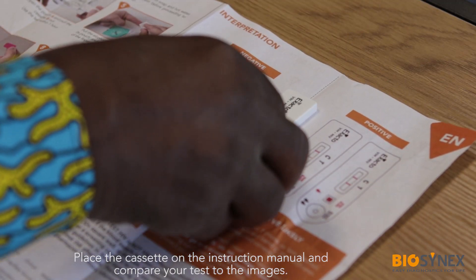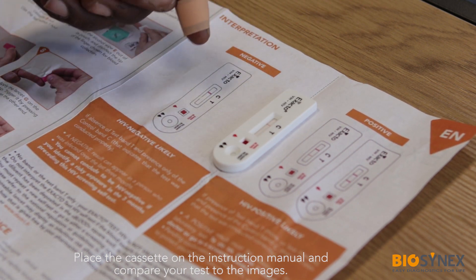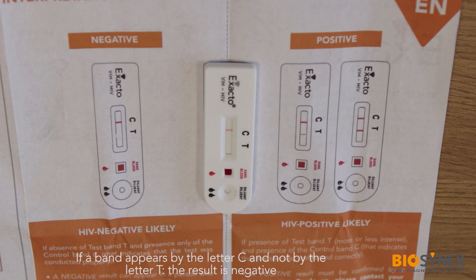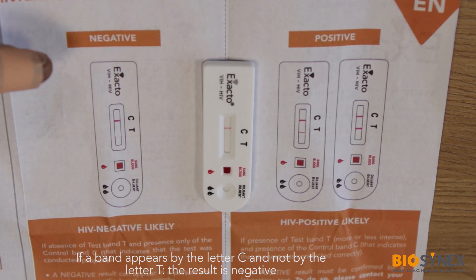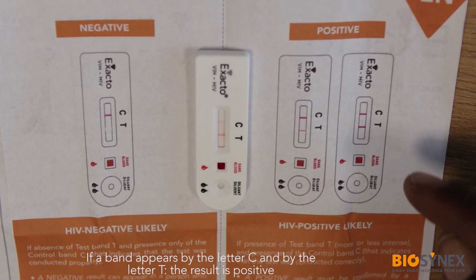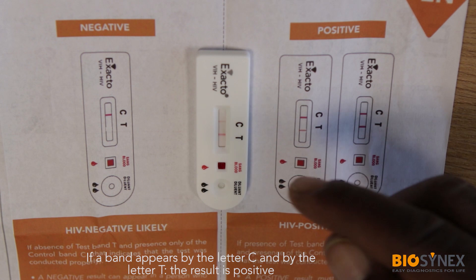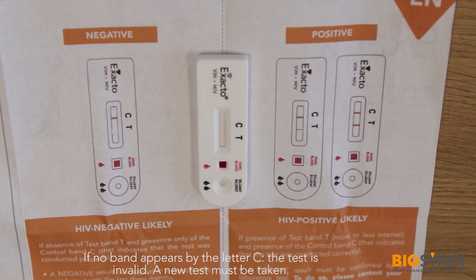10 minutes have passed. You can now compare the result of your test with the images provided in the instruction manual. If a band appears by the letter C and not by the letter T, the test is negative. If a band appears by both the letter C and the letter T, the test is likely to be positive. If no band appears by the letter C, the test is invalid and a new test must be taken.